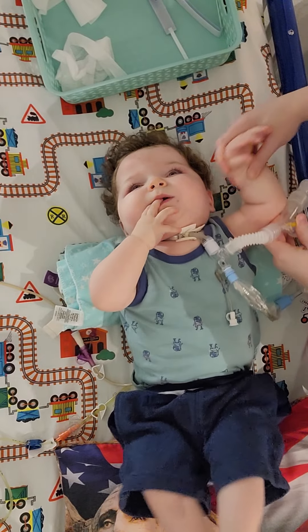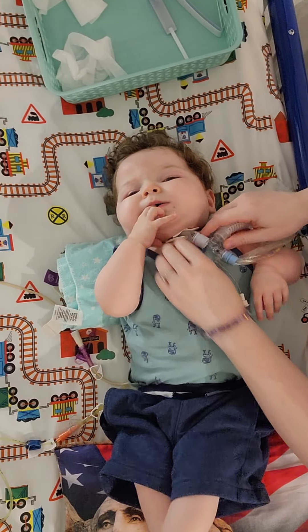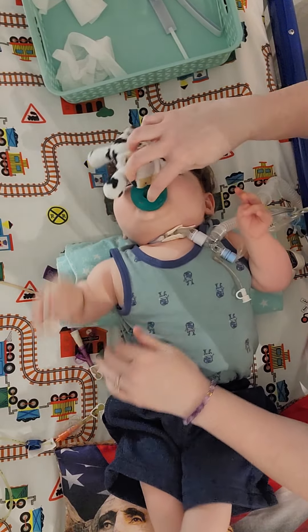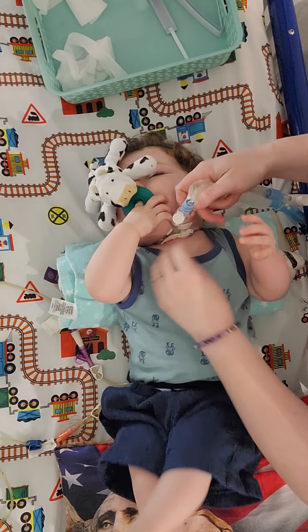We have a nice thick roll under his neck. I try to put his arms underneath the circuit. I don't swaddle him anymore even though he is teething — he's putting his hands in his mouth. I try putting a pacifier upside down; sometimes that works.